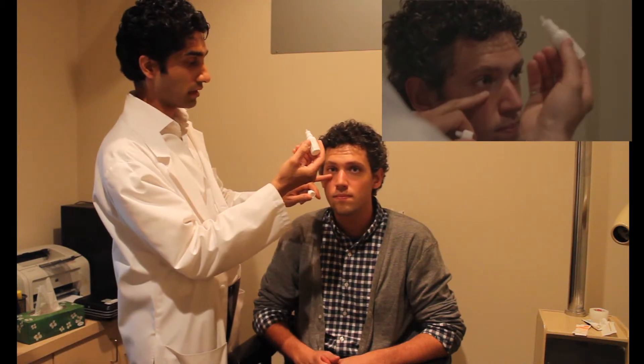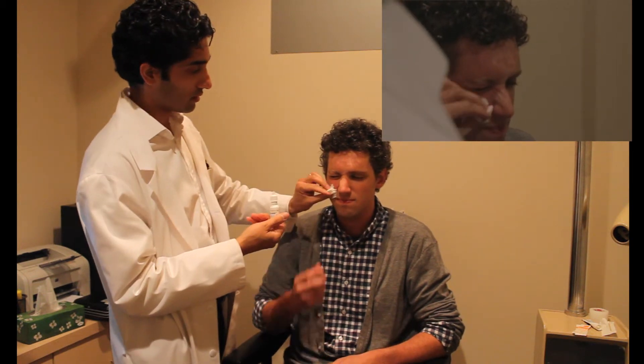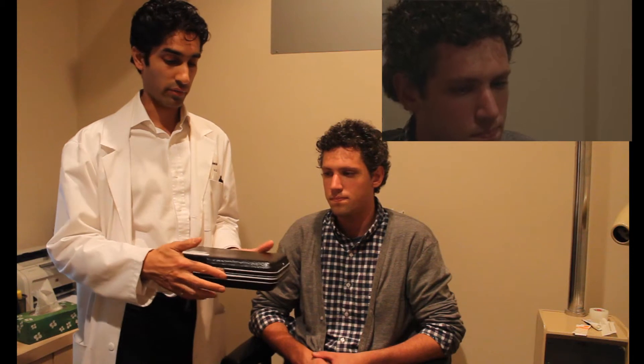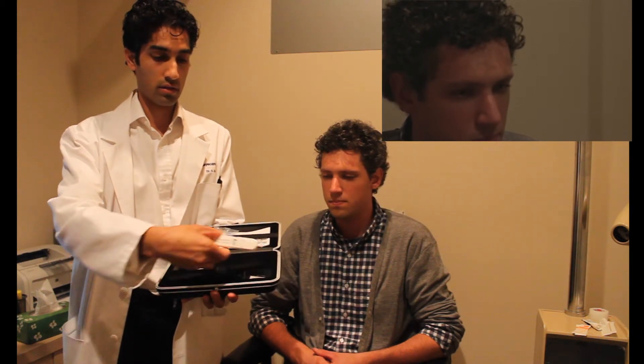Now we're going to learn how to do tonometry with the Tonipen. First, wash your hands. Since we have to touch the eye to check eye pressure, we'll put in some topical anesthetic. In most emergency departments and clinics you'll find a box that contains the Tonipen — this is probably the easiest instrument to use to check pressure. When you open the box you'll see the instrument itself along with an extra head cover.